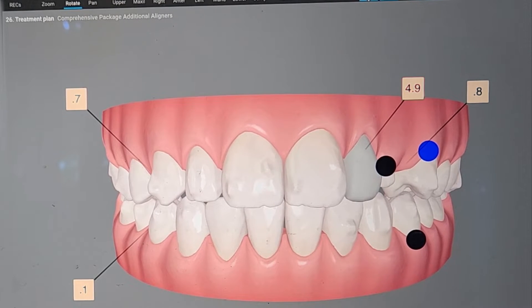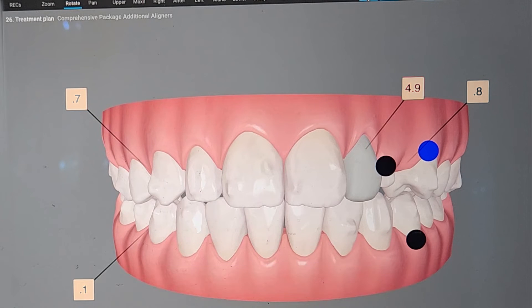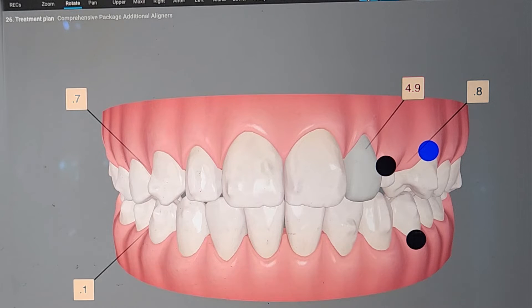Hey, it's Dr. Amanda with Straight Smile Solutions, straightsmilesolutions.com. And today, I haven't done this in a while. Let me take you on a little tour of ClinCheck 6.0 and some of my favorite buttons and kind of how I review a case. I do have permission to show this case, but not the photos. I will show you how to use the dashboard and what I do when I get a case.